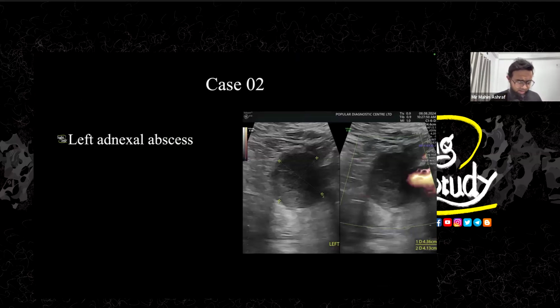Let me just shake the live content a little so that I can see any abnormality going on there. Okay, sorry. Okay, so everything looks quite good.